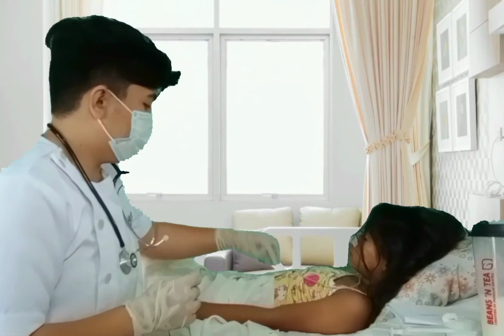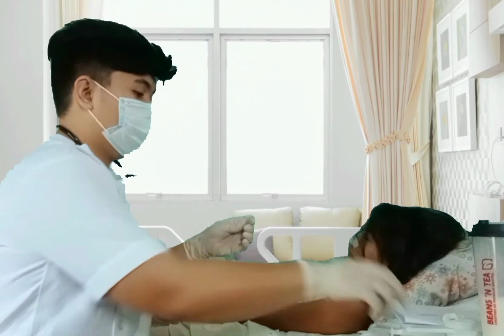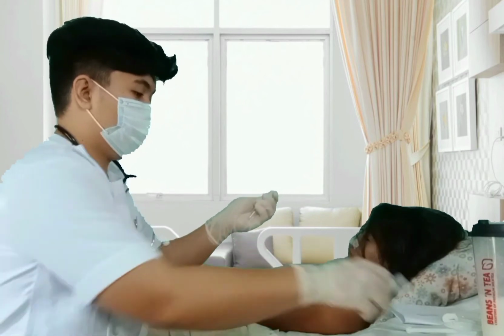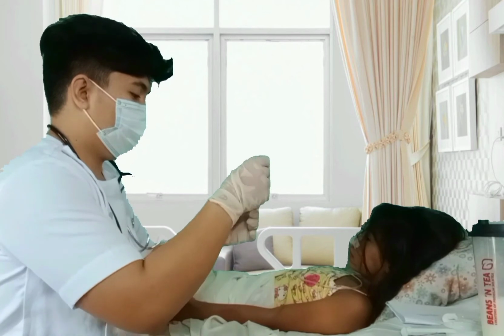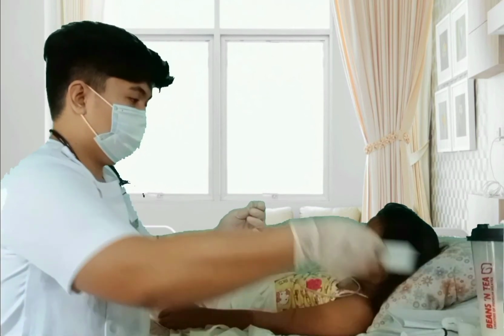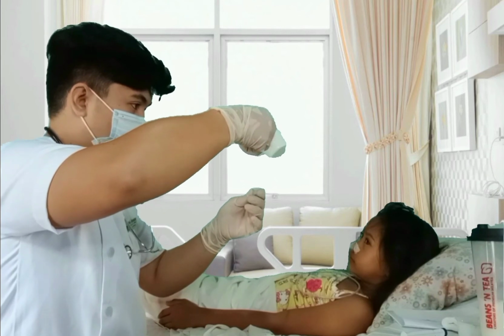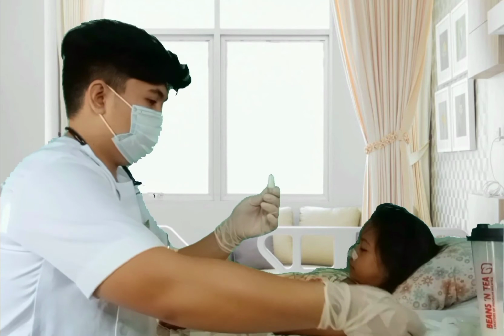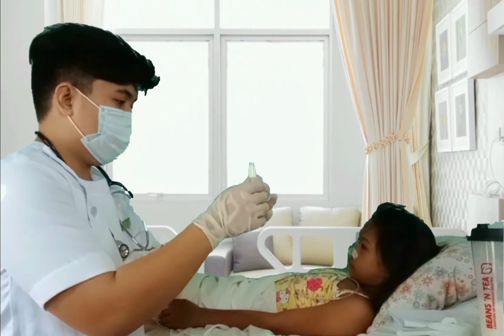Step 6. Initiate feeding. Pinch proximal end of the feeding tube to prevent air from entering client's stomach. Remove plunger from syringe and attach barrel of syringe to end of tube. Fill syringe with measured amount of formula, release tube, and hold syringe high enough to allow it to empty gradually by gravity. Refill and repeat until prescribed amount has been delivered to the client.